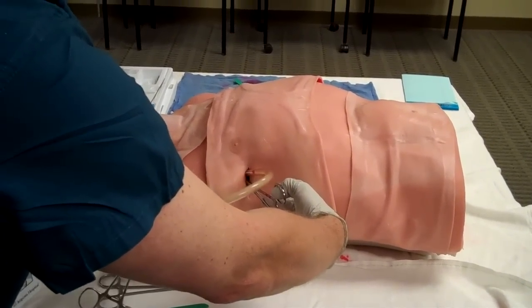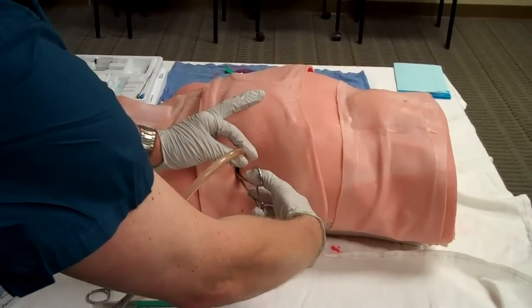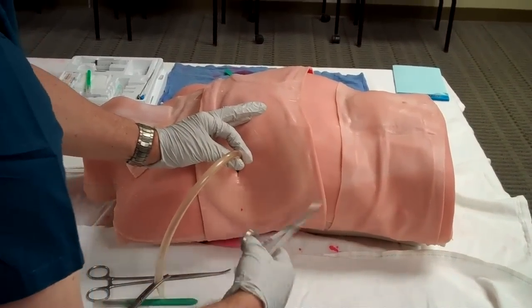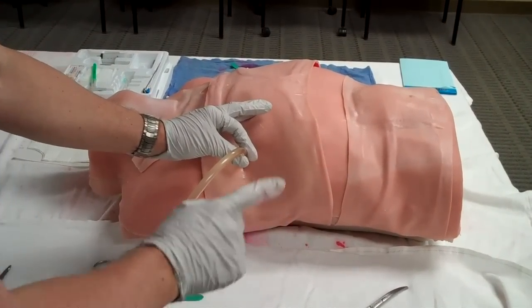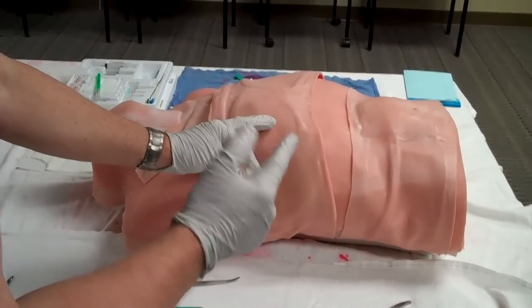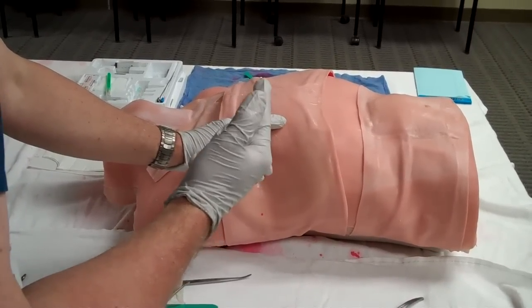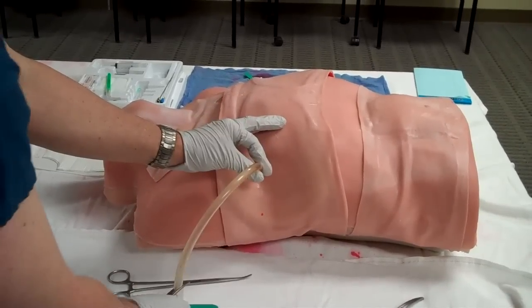And then once I've got it in a comfortable distance, I'll hold the tube and then unclamp the clamp and pull it out. And this is key. You do not want to pull your chest tube out as this is coming out. Some people talk a lot about, oh, I want to direct it anterior or posterior. The simple truth is that once the tube leaves your clamp, you have no control over where it goes.